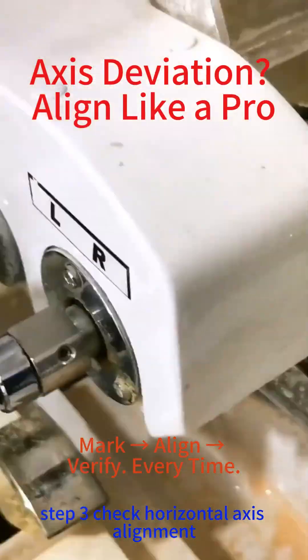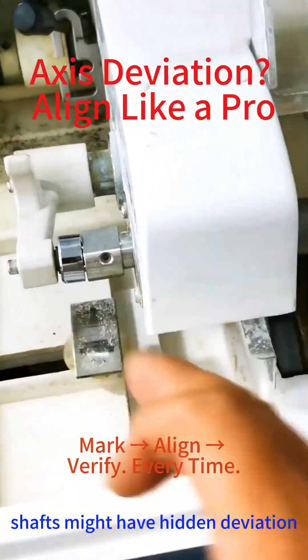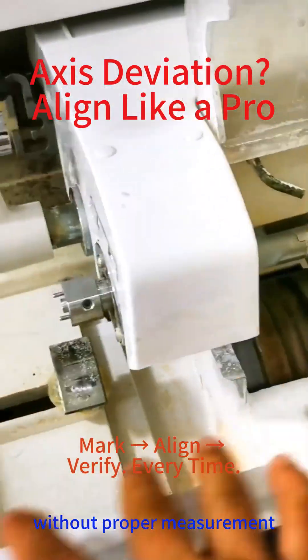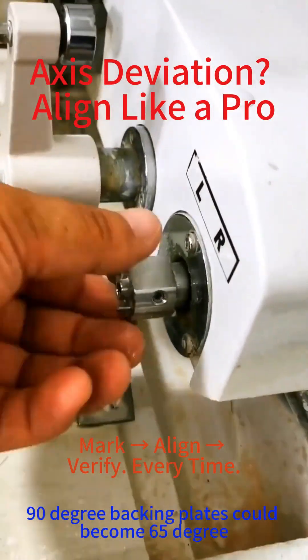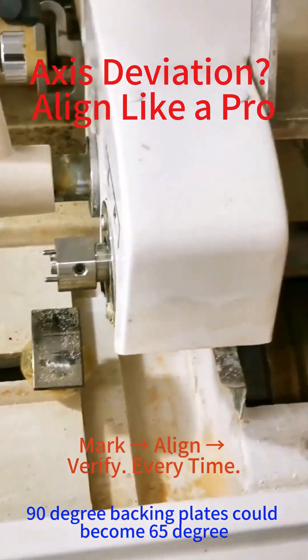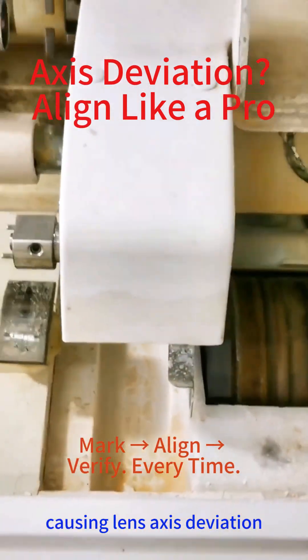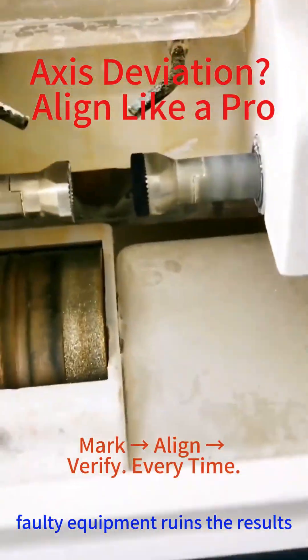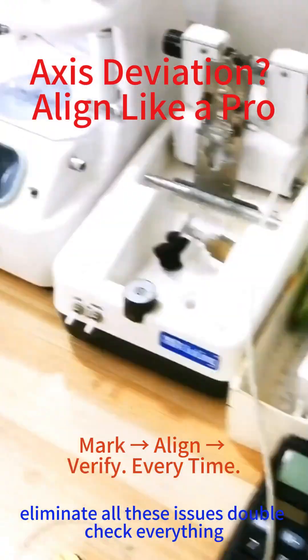Step 3: Check horizontal axis alignment — shafts might have hidden deviation. Use a laser level tool for precision. Without proper measurement, 90-degree backing plates could become 65 degrees, causing lens axis deviation even with correct methods. Faulty equipment ruins the results, so eliminate all these issues and double-check everything.